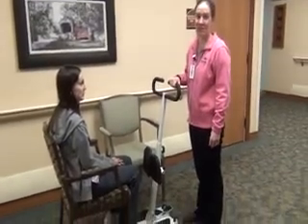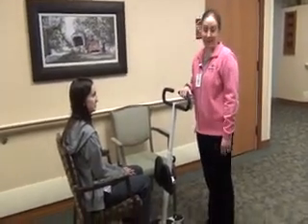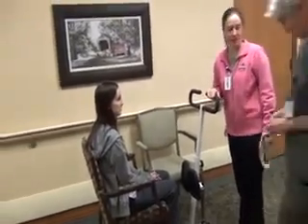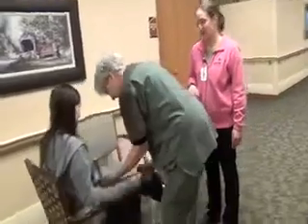We are going to show you today the proper technique for using the standing disc to transfer a patient. The first thing is we need two people to assist with this transfer. One person is going to put the gait belt correctly on the patient — low at the waist and snug.